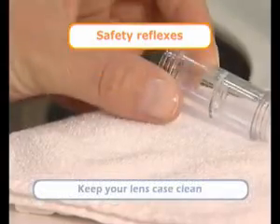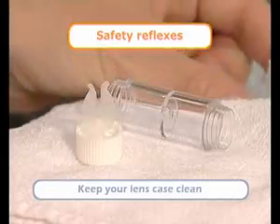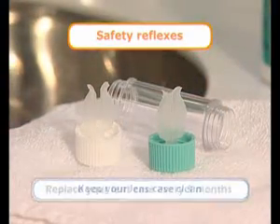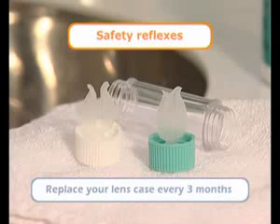Keep your lens case clean — always empty it, then clean and rinse it with your solution before letting it air dry. Replace your lens case every three months.